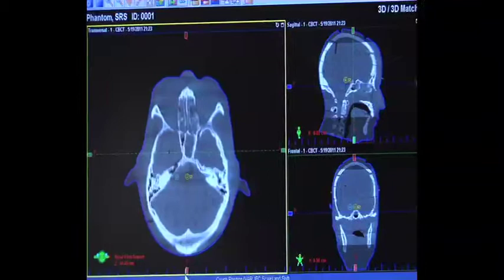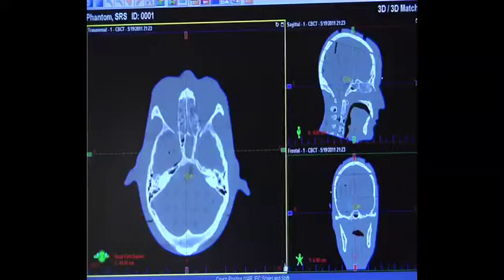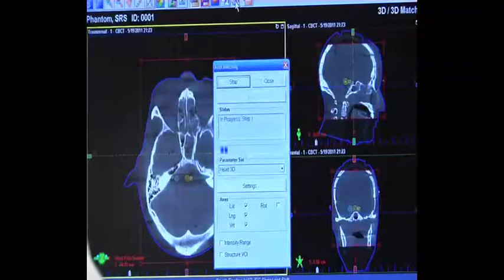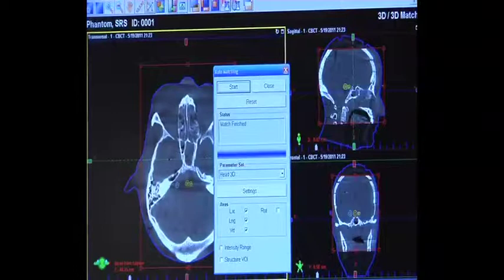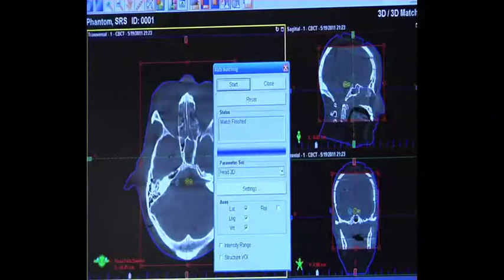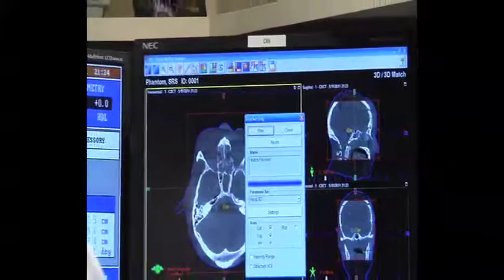In this OBI window, I can toggle between my cone beam CT acquisition and my planning CT acquisition. I can use automatic fusion or manual fusion. In this case, I am going to perform automatic fusion and see what my discrepancies are. Based on this fusion, I get about a 2 mm discrepancy in the vertical direction. This does not pass my QA test because my tolerance is 1 mm. So with a failure, we have to investigate the source of the discrepancy.